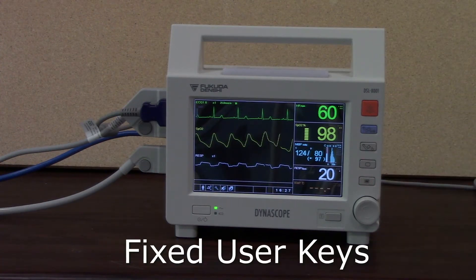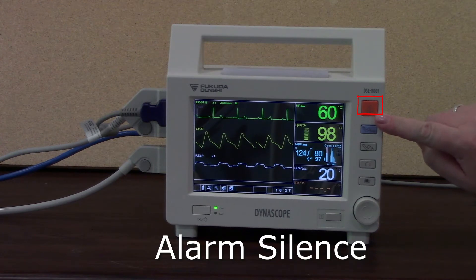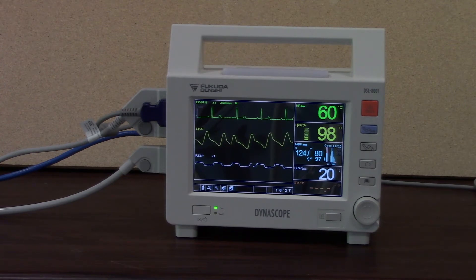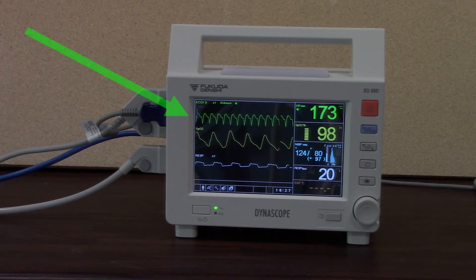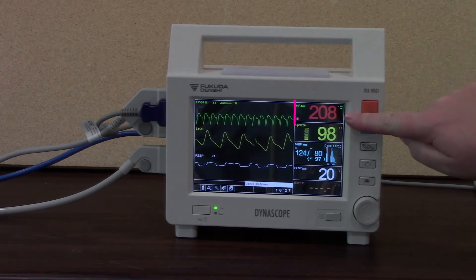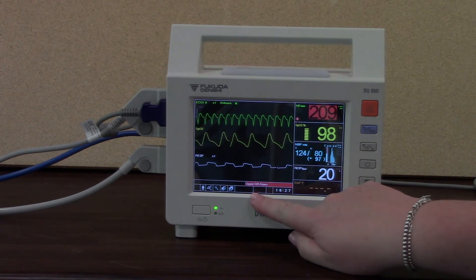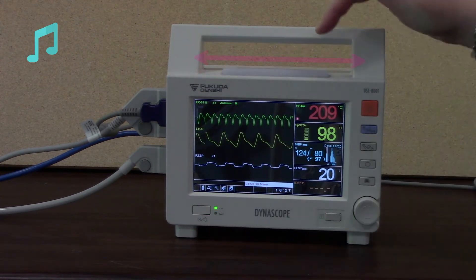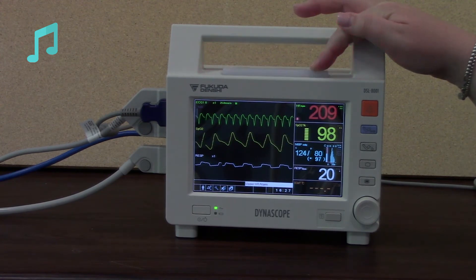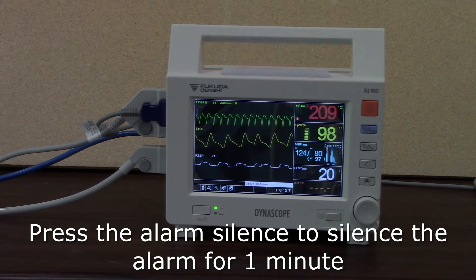Down the side you've got some fixed user keys. The very top button is the alarm silence, which will silence a parameter-specific alarm for one minute. I'm going to set an alarm off so we can see what happens. We've got an arrhythmia on the screen — as soon as the monitor picks that up, it highlights the parameter in red and tells you down here that we've got an alarm condition, in this case an upper heart rate alarm. It also flashes red at the top. If I press the alarm silence button, it will silence that alarm for one minute.